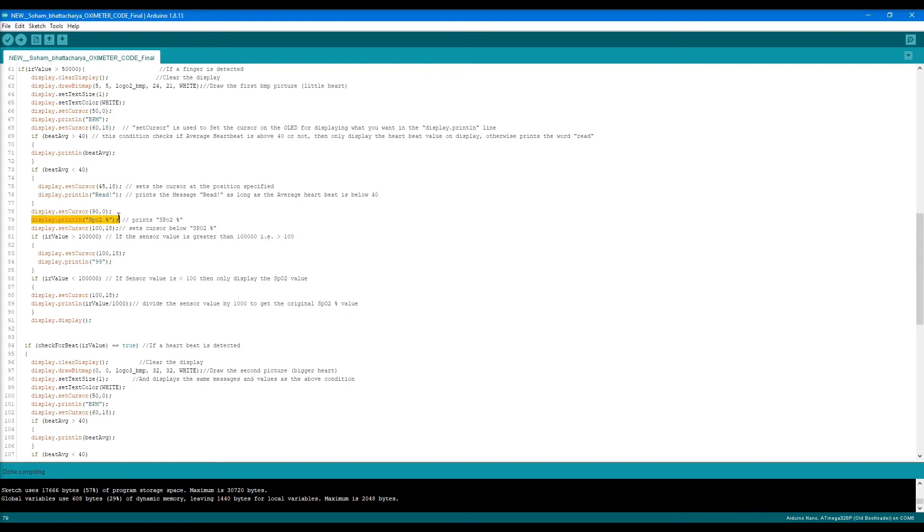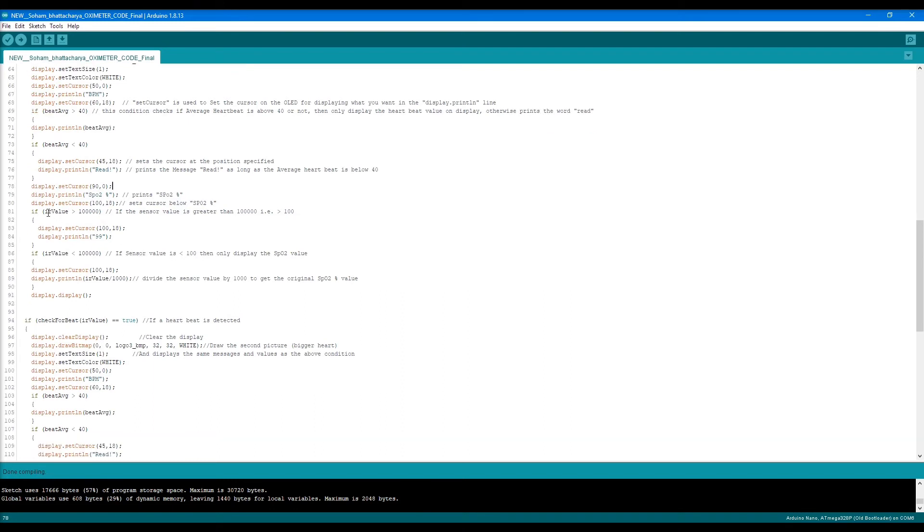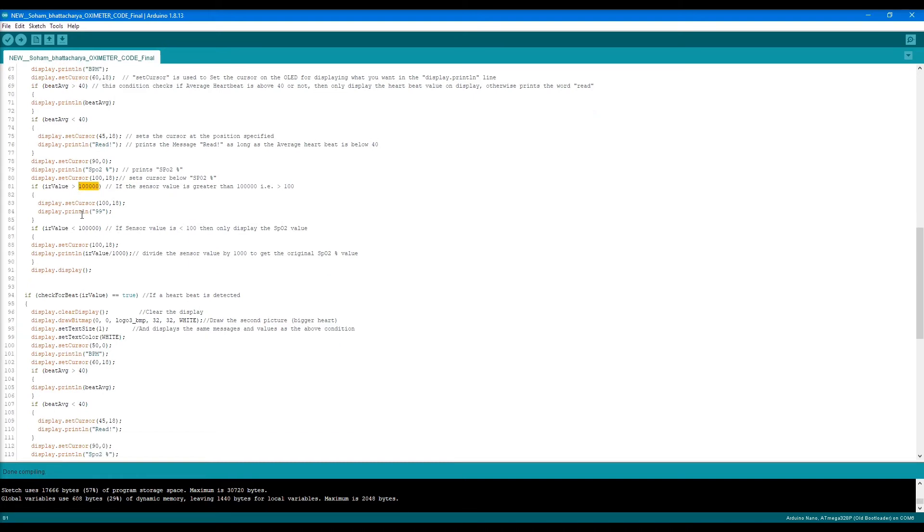Next we set the cursor again to display the SpO2. It writes the SpO2, then we set the cursor again. There's an if statement that if the sensor value is greater than this value, then we display 99.